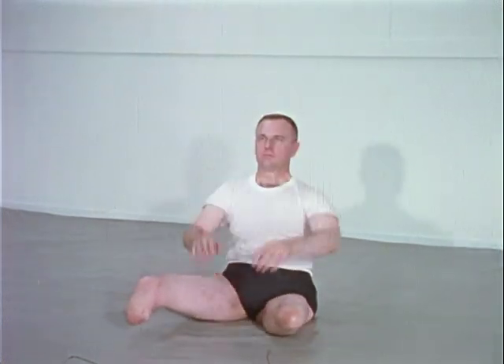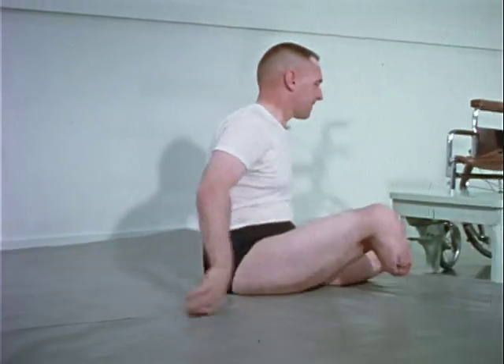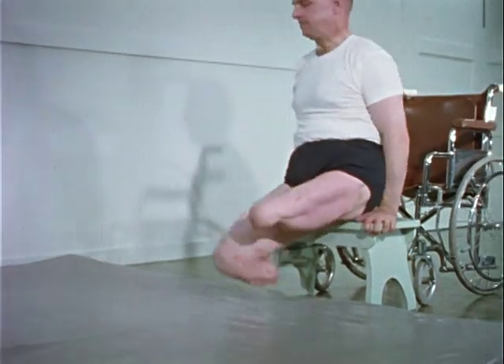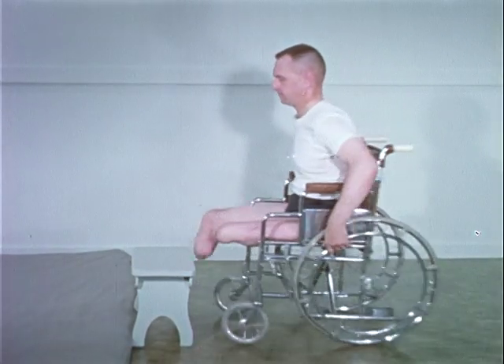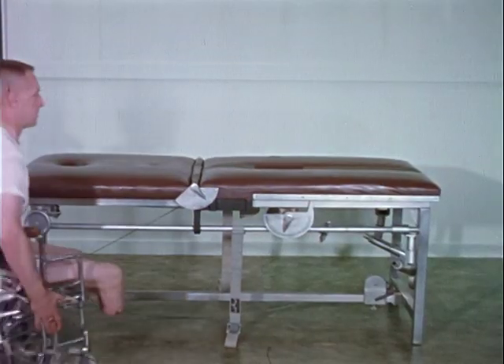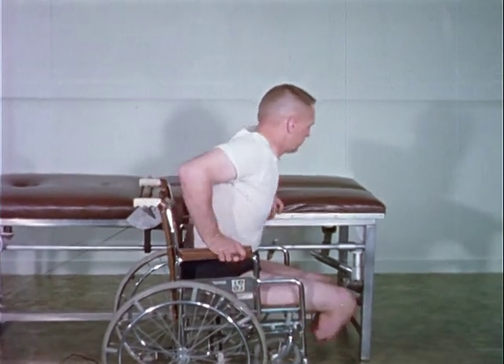Functional activities which will help the patient become independent are emphasized from the beginning of the mat program. The amputee learns to get from the mat to the wheelchair unassisted. As the condition of the stump improves, mechanical pulley resistance may be utilized to assist in developing muscle strength.